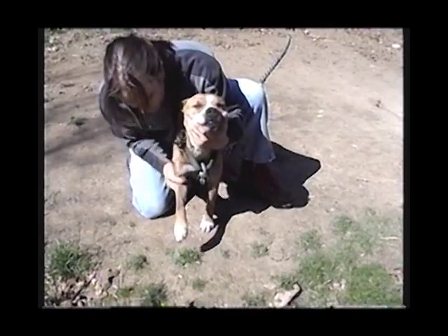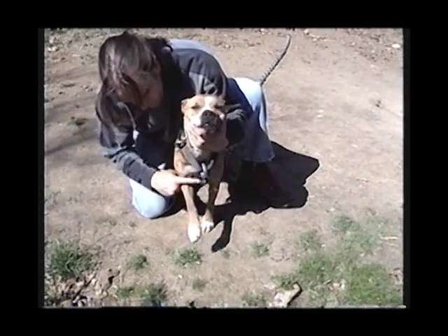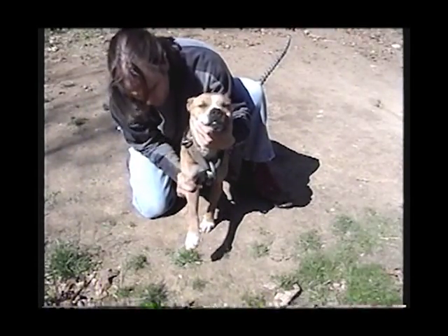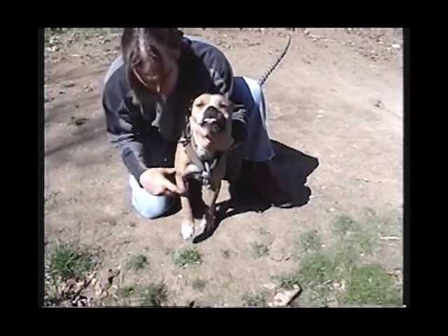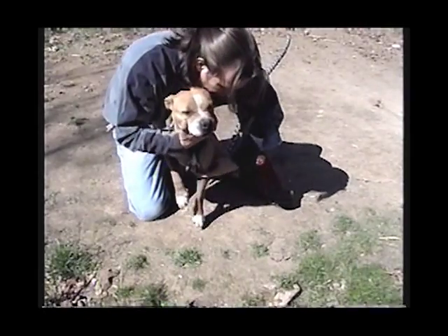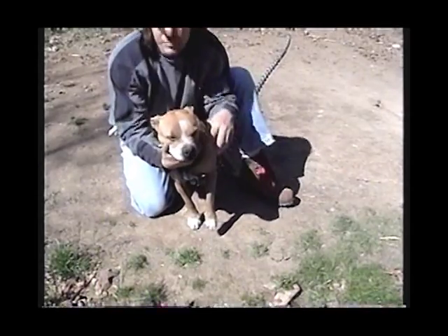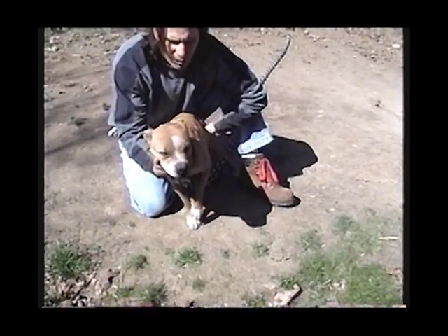You don't want to choke her — I've seen people almost choke a dog to death. You hold it like this, grab here, present the arm and turn, and that will get the vein sticking out. This will be for a left-handed person; right-handed person, you grab this arm and hold this leg out. Now I'm going to show you how you can do it by yourself without any help at all.